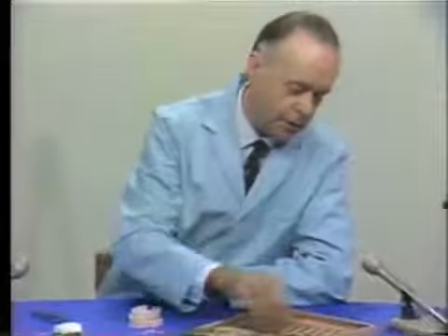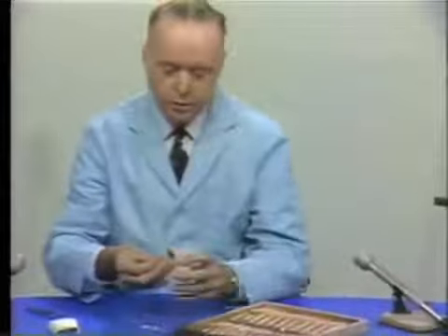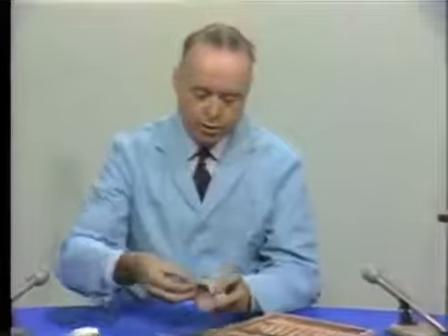So if you've got a clinical case such as this with a missing lateral incisor and you want to select a facing for it, then measure the width here with either a Boley gauge or with a suitable pair of dividers like this, and then run through the selection here of the lateral incisors until you find one that is about the right size. Pull it off and then try that in position on the cast, as you see there.